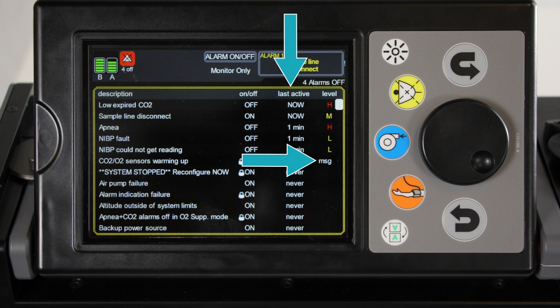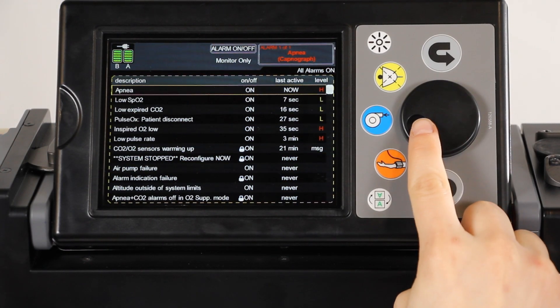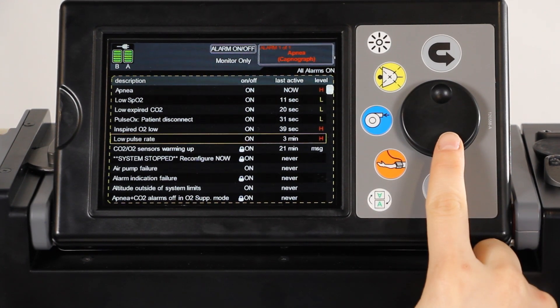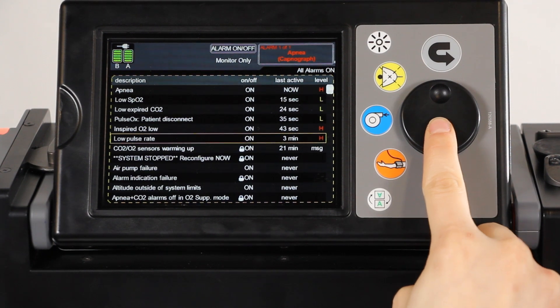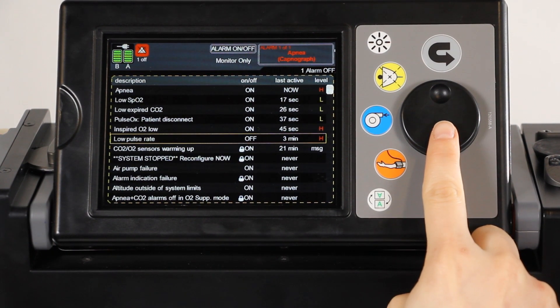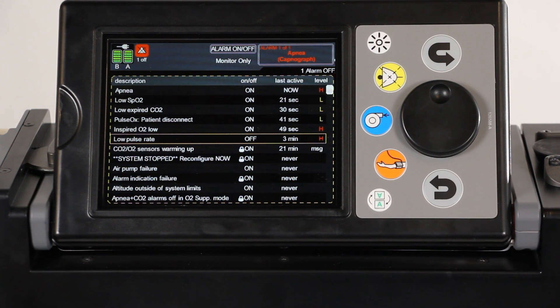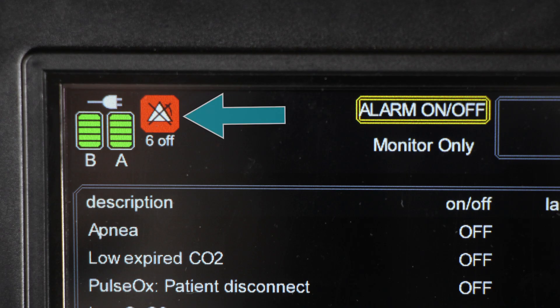The MOVES SLC will also indicate when the alarm was last active. The list of alarms is scrollable once it has been activated. To modify an alarm, select an alarm — a selection is indicated by a yellow box around the limit — then press the jog wheel to turn the alarm on or off. When an alarm is turned off, a red icon containing a white triangle with an X through it will appear on the main screen. The number of alarms turned off is shown below the icon.